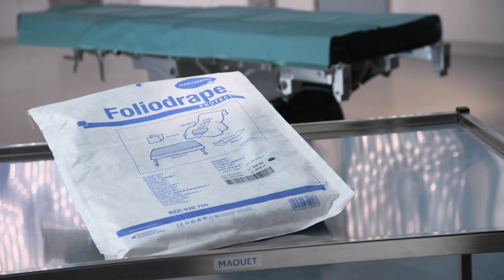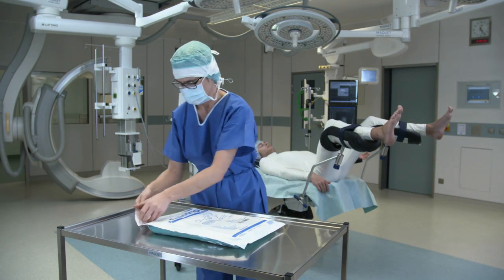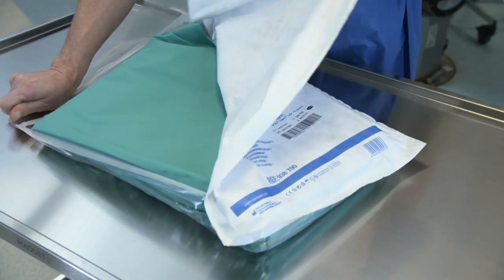The FolioDrape Protect Urology Set 1 from Haltmann facilitates fast and safe preparation of the patient for urological surgery.